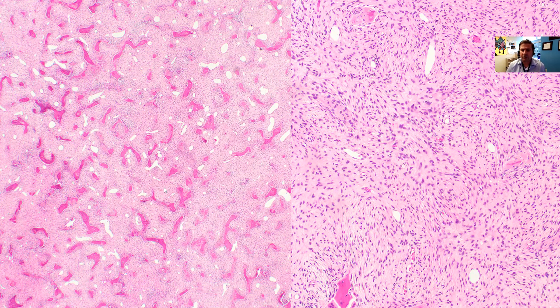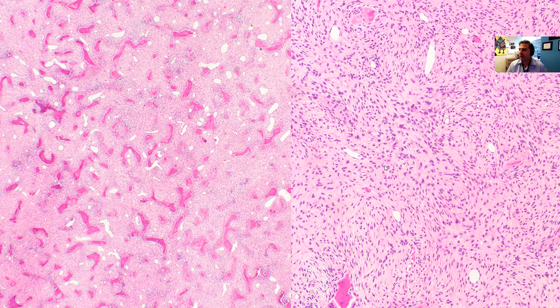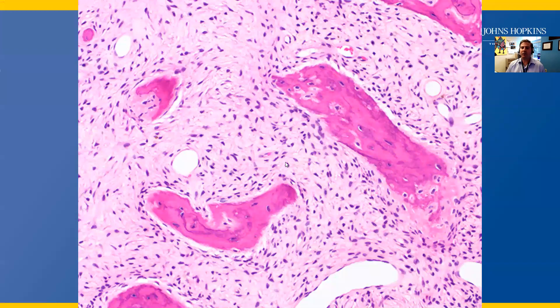Furthermore, the background stroma is quite bland — we can see this even at this low power. Finally, there's a prominent vascular pattern composed of ectatic and staghorn vessels. On the right, you see this very bland spindle cell stroma that's growing in a storiform pattern. At higher power view, we can see that these bland spindle cells are directly producing this bone.